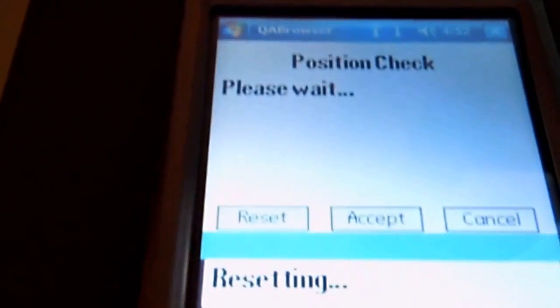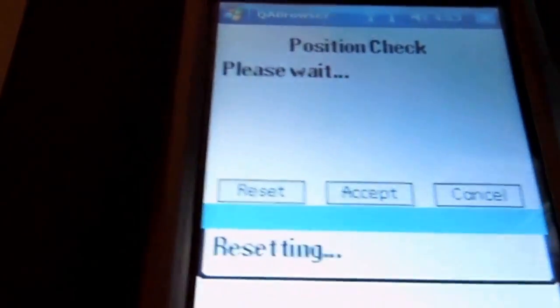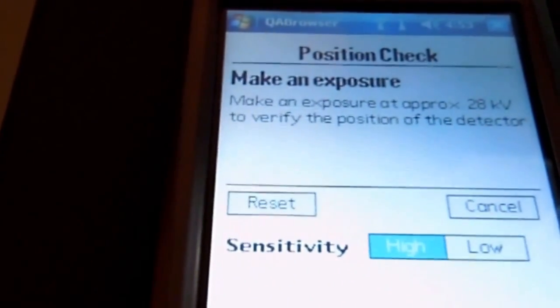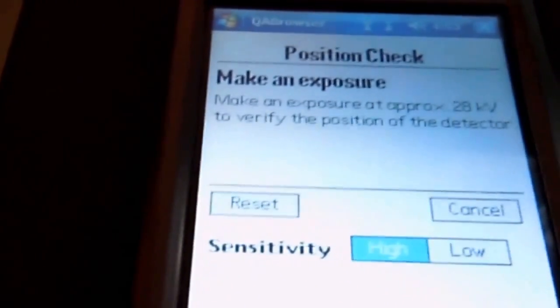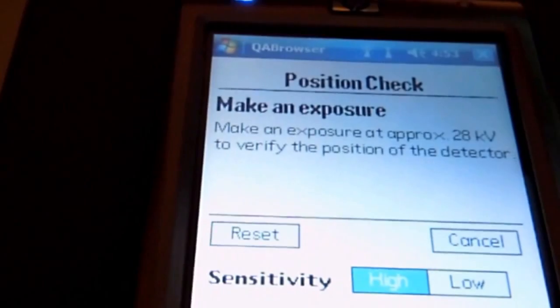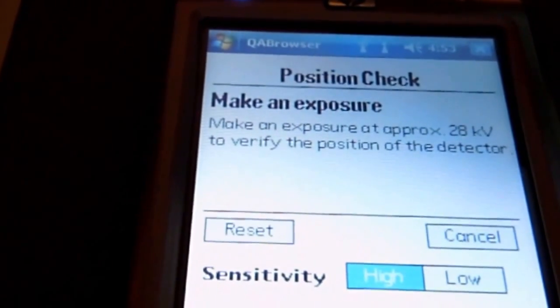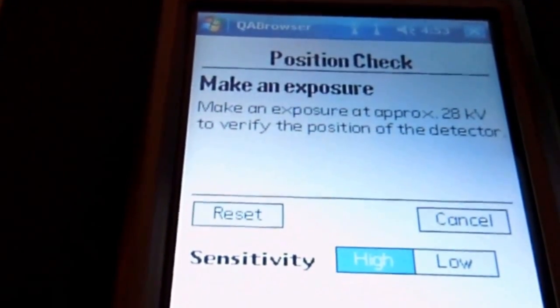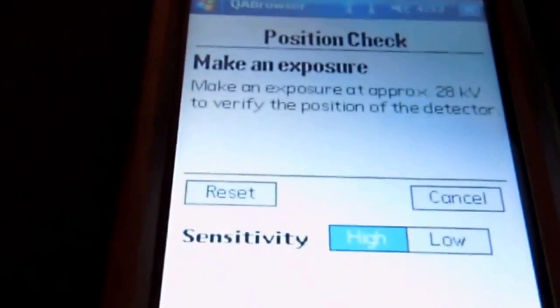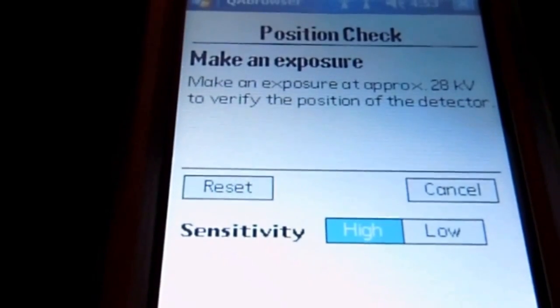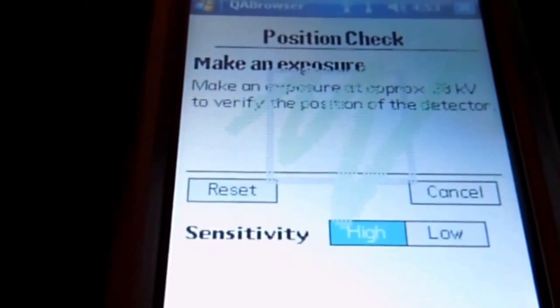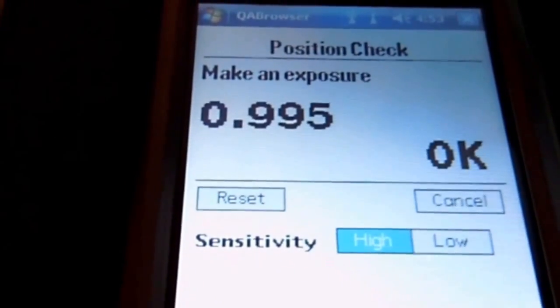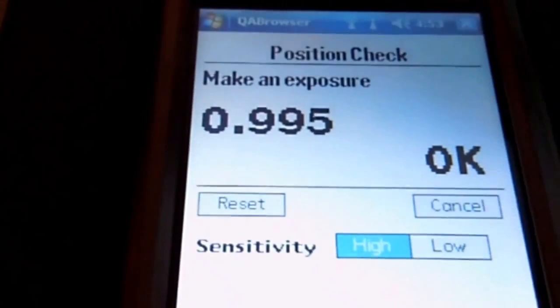We're going to do a position check. We're doing a position check at 28 KV. That's okay.